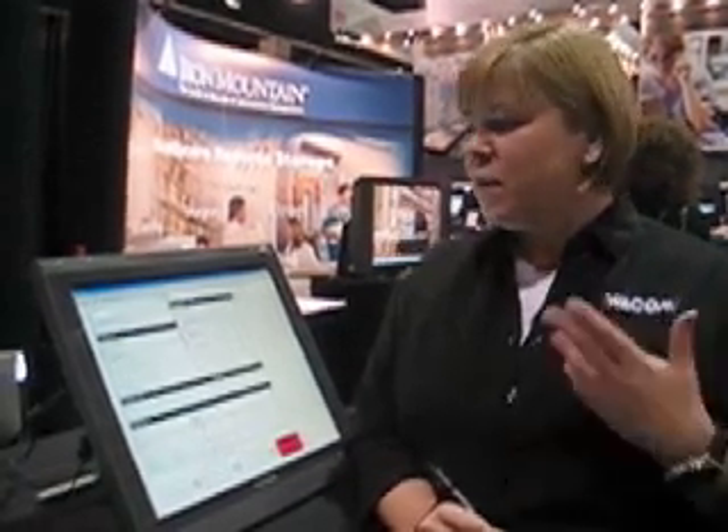Hi, this is Donna Cotman. I'm with Wacom Technology. We're here at the SIIM 2007 show, and we're here showing our pen displays to the radiology crowd here today.